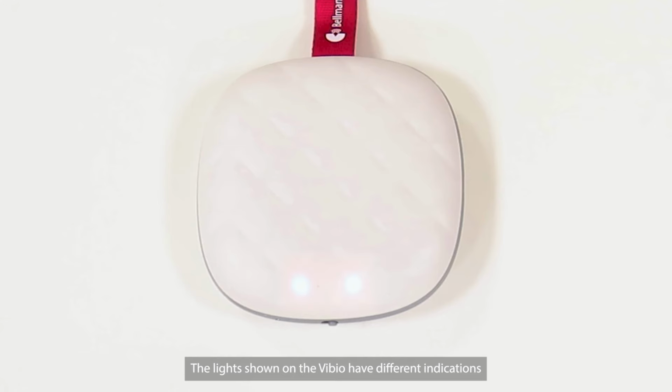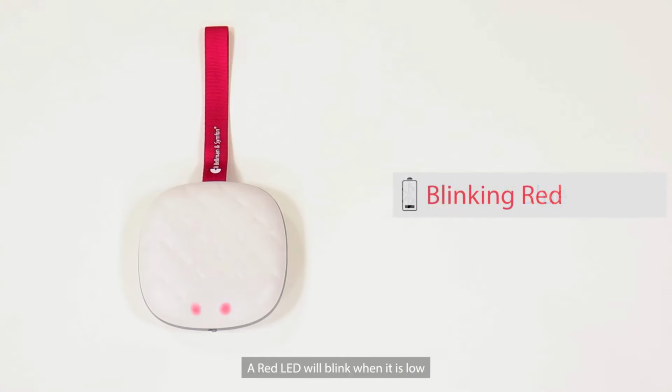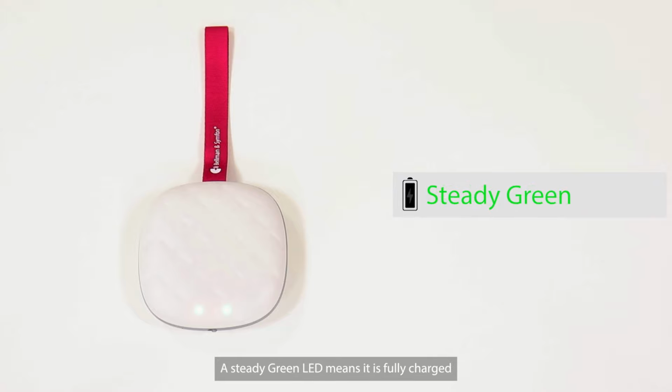The lights shown on the Vibio have different indications. They only show when there is an action performed with the Vibio or the app. A blue LED will blink slowly when the Vibio is waiting to be paired. A red LED will blink when the battery is low. A green LED blinking means it is charging. A steady green LED means it is fully charged. The battery takes 1.5 hours to charge and can last up to 10 days after fully charging.